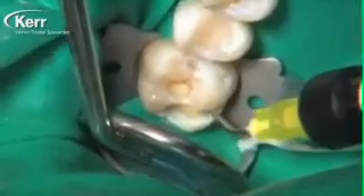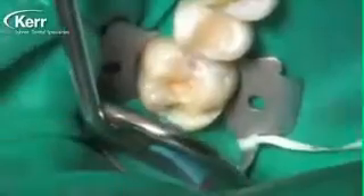We place our first increment and then use the enclosed brush to take that material — and we're not just thinning here, you really want to agitate it into the tooth structure and into the preparation for 15 to 20 seconds. Be sure to use the paintbrush that comes with the Dyad Flow and not a tumbleweed brush, micro brush, or anything like that, as those incorporate too much air into the composite. The enclosed paintbrushes work perfectly for smearing the Dyad Flow around the inside of the cavity preparation.